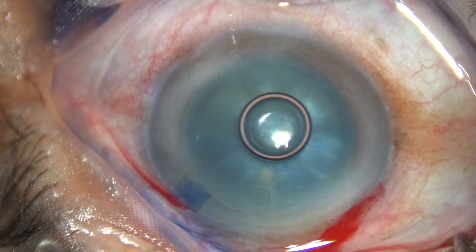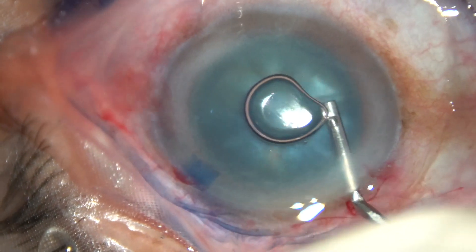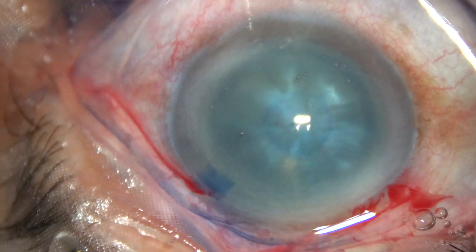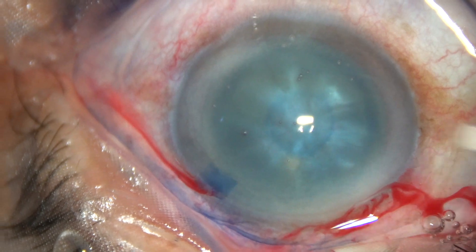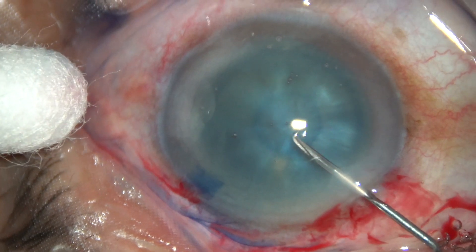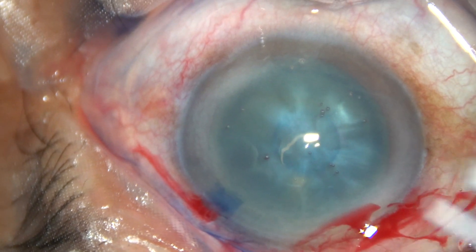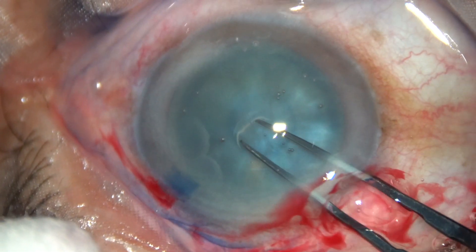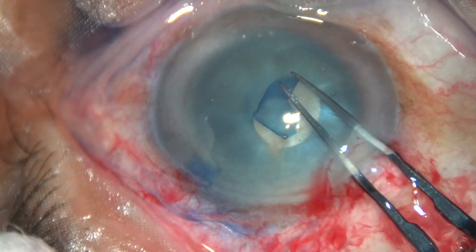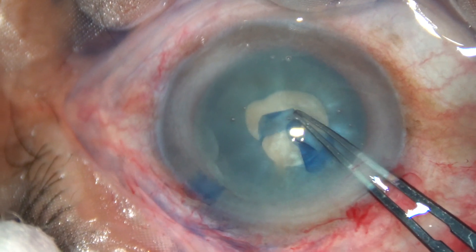This case is more intumescent. The anterior capsule has been stained. This is 2% hydroxypropyl methyl cellulose filling of the anterior chamber. In this case, I have not made a side port, so making a very small flap. It should not be a radial cut — it should be a curved flap. Hold this capsular tag and convert this tag into a small rexis.